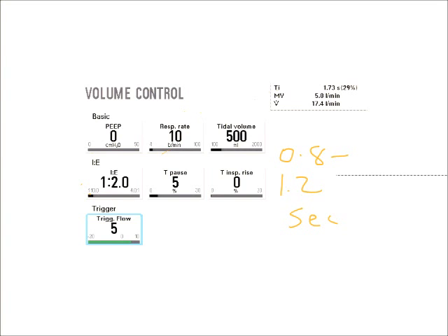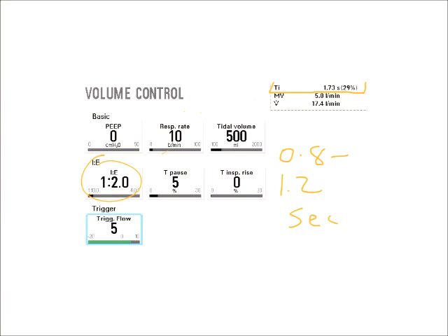So setting it too short will lead to ineffective tidal volume delivery and oxygenation, and too long may be very uncomfortable for the patient. As you notice, my TI setting or calculated setting based on my I:E ratio is 1.73 seconds. So if the patient was spontaneously breathing, this may be uncomfortable for the patient.